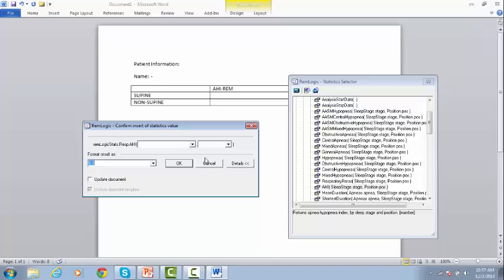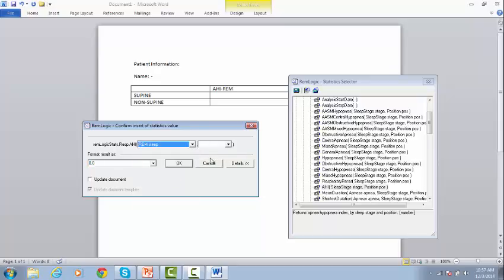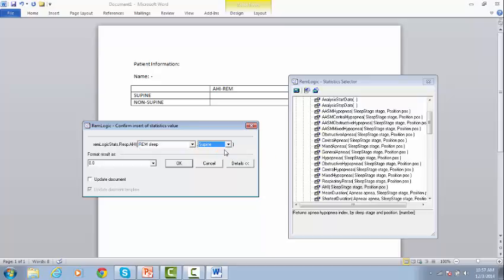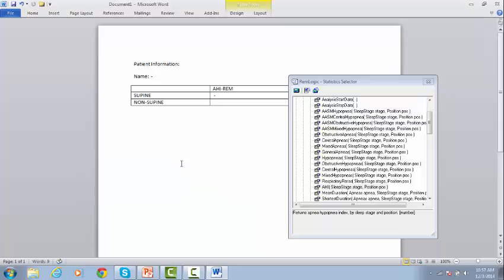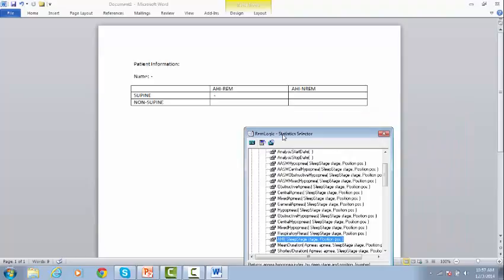The statistics value window will pop up. Select the required options, and in this case, we want to show the AHI during NREM Sleep, and in relation to supine position. Then click OK.